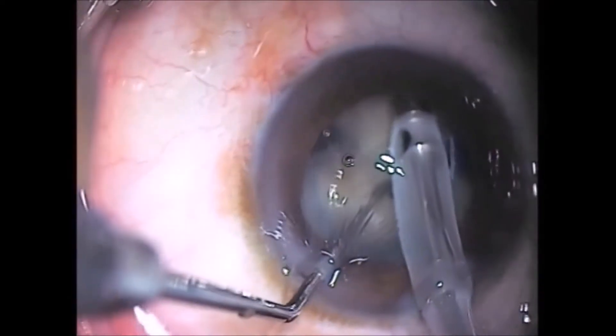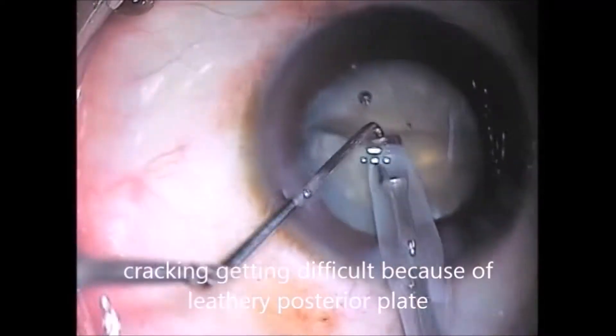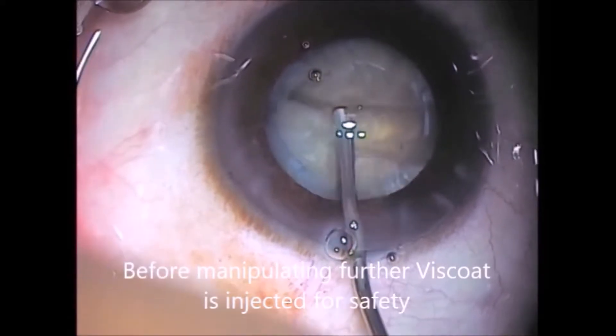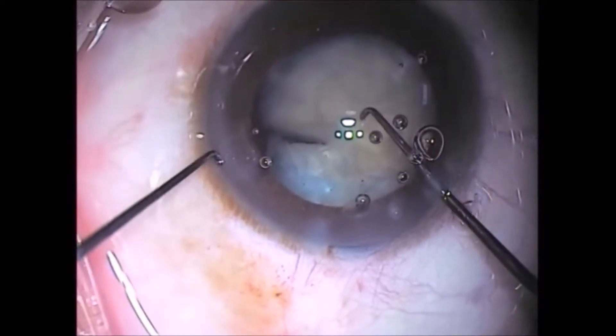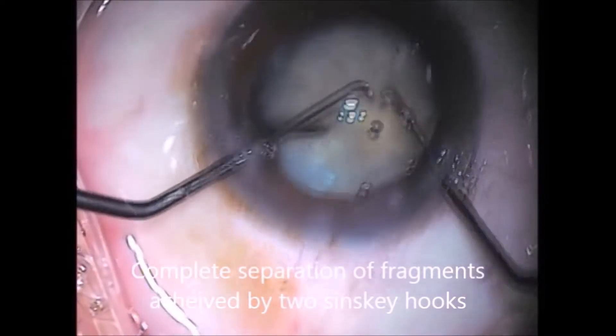As the posterior plate is very tough, the segments are not getting separated easily. A good dispersive viscoelastic is used to protect the posterior capsule, and two Sinskey hooks are used to separate the two fragments.